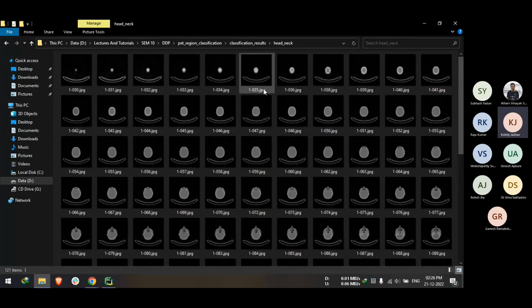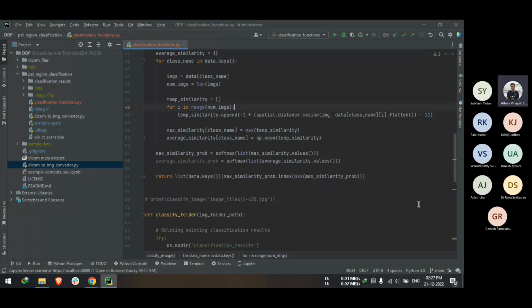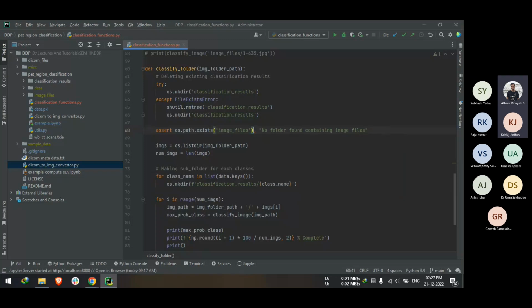Yeah. So Dr. Ashish, last time we had shown that Atharva could automate the SUVmax in each image. And right now, what he's doing is classifying the input images into the 4 subcategories. The next step actually is to identify the organs within each subcategory that he has classified them into, and we'll be working towards that before the next meeting. And the final goal would be to then, sorry, go on.